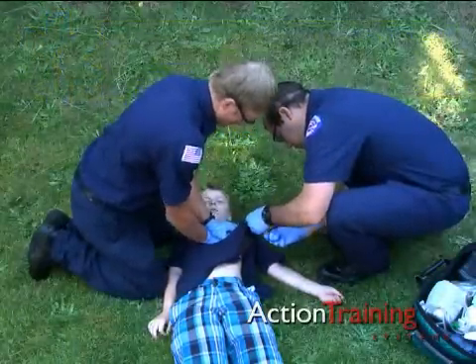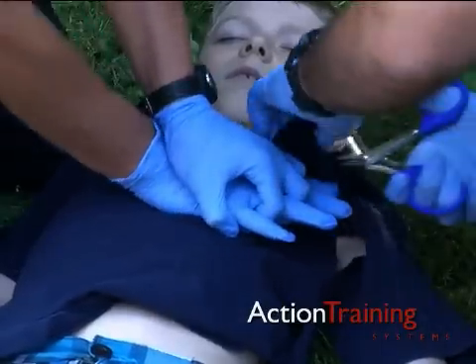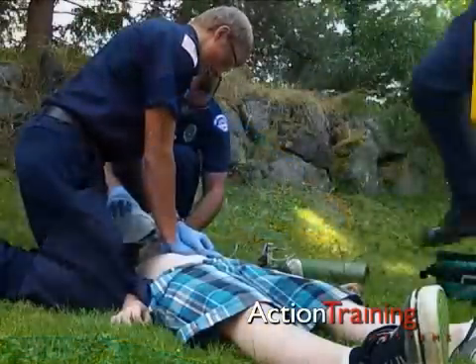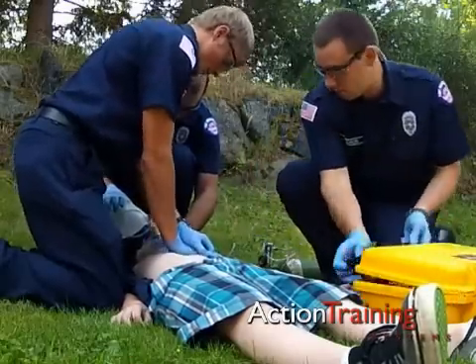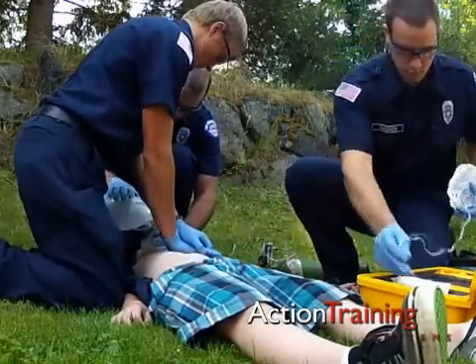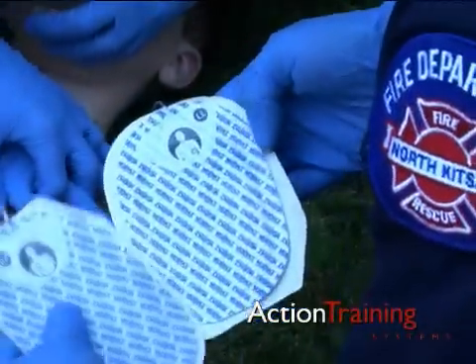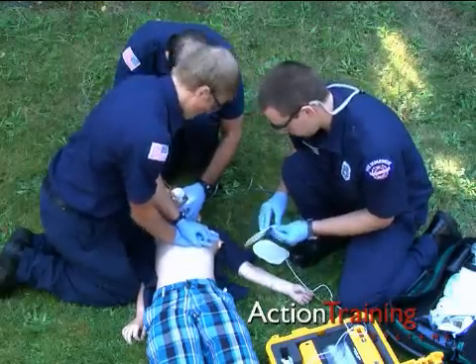AEDs may be used for pediatric patients. If the patient is an infant or a child between one year of age and puberty, use an AED with a dose-attenuating system that reduces the charge delivered if you have one. Use an adult system if you do not. While manual AEDs are preferred for infants, they can only be used by ALS personnel.